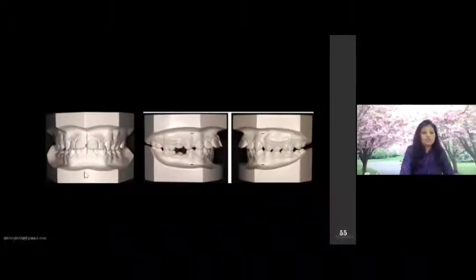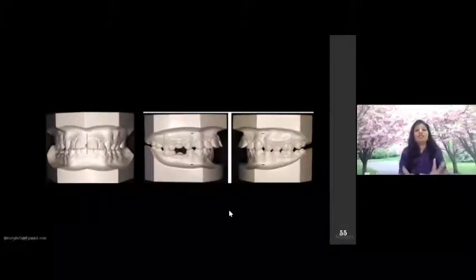So you are supposed to check for the midline matching, and then you will draw a single line passing through the distobuccal cusp of your maxillary molar, extending onto the mandibular molar as well, like this straight line. It has to be drawn on both the right and left side of your model. Later, you will also mark two points, one at the upper canine region, the other at the lower canine region. Both right side and left side, you're supposed to mark it. And later, you're supposed to use a vernier caliper to measure the distance between these 2 points. Right side and left side need to be measured and kept on a sheet of paper.